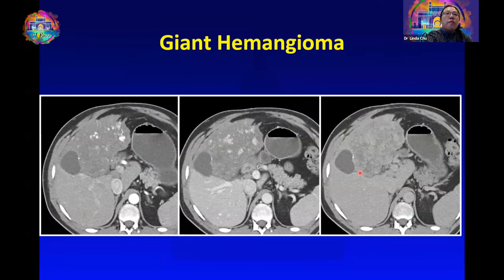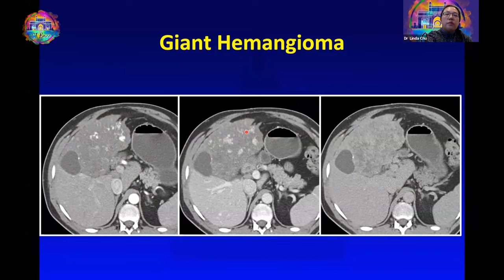With giant hemangiomas, sometimes the enhancement pattern looks a little less classic. The nodular enhancement on the arterial phase is not quite as peripheral as we are used to seeing, but at least it's following blood pool attenuation. The enhancement pattern through the venous and delayed phase images is progressive, which is a reassuring sign.